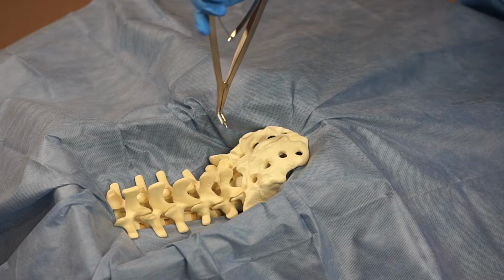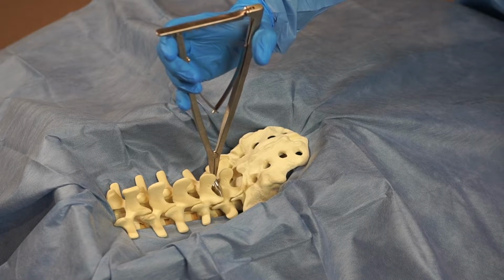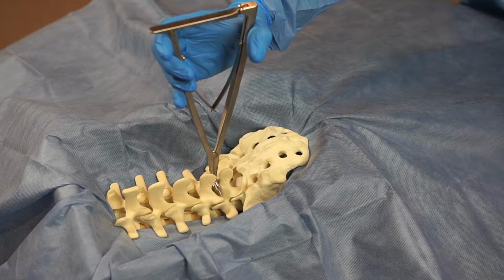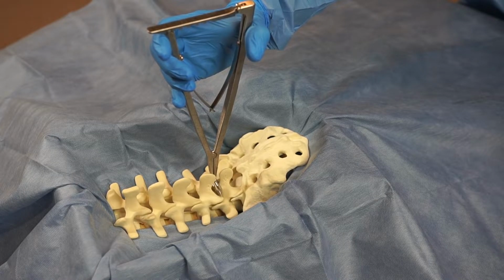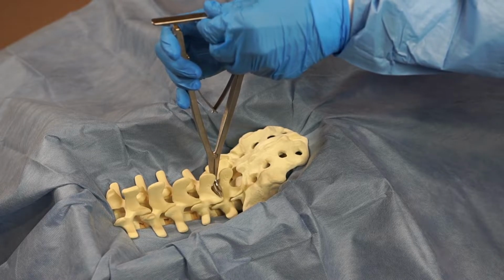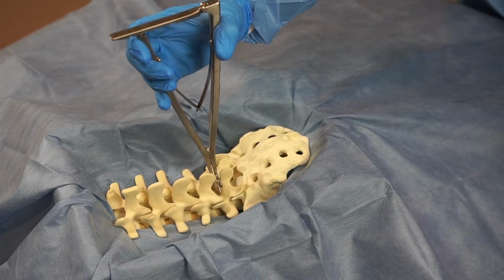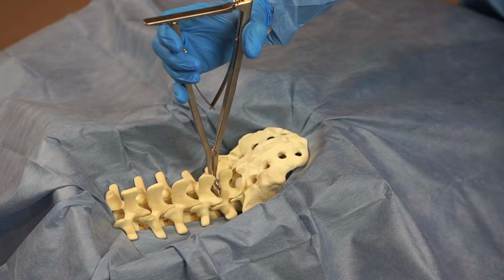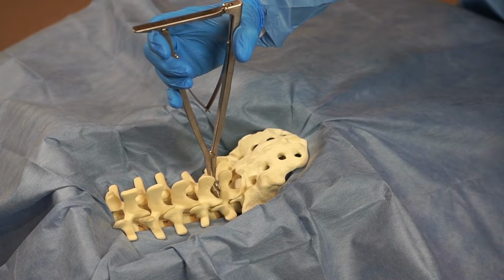If the ligament is left intact, insert the universal rasp with the ratchet arm in the down position into the appropriate level between the spinous processes and puncture the interspinous ligament, placing it as far anterior as possible. Lifting the ratchet arm slightly and using slight squeezing pressure, slightly rotate the universal rasp cephalad and caudad to ensure full insertion into the interspinous space.